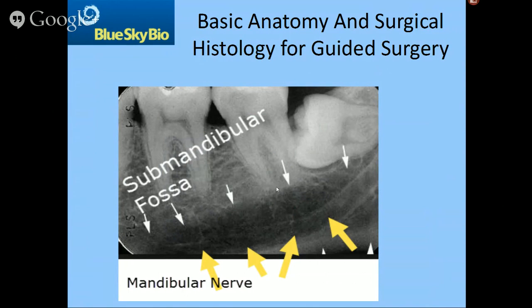Some people will say, well, if you have a molar in the back, you can figure out where the mental foramen is and draw a line from the mental foramen back, connecting to the roots, and that's good enough. You know what? It is good enough, but I wouldn't do it anyway, because it becomes non-defensible in a situation where you did get a little too close.